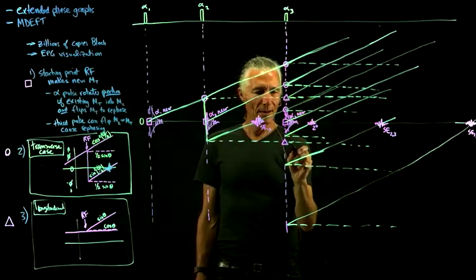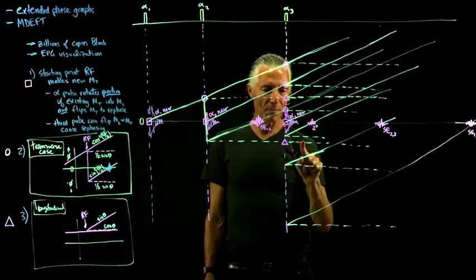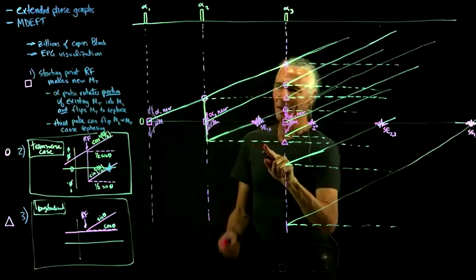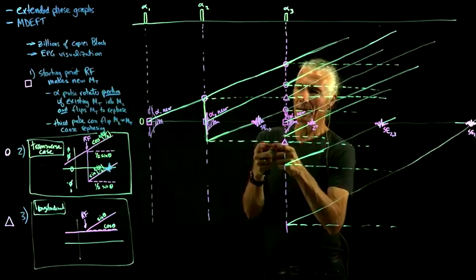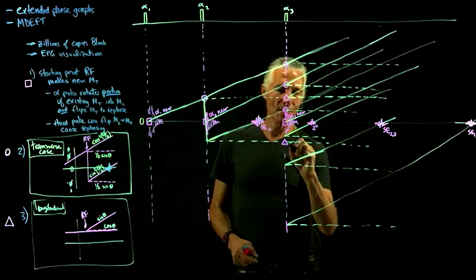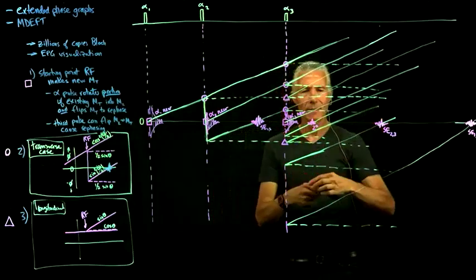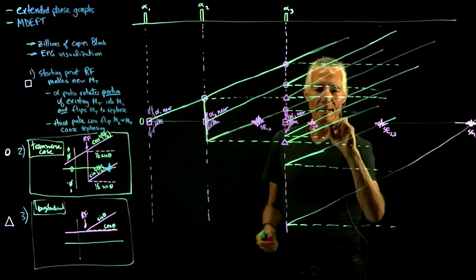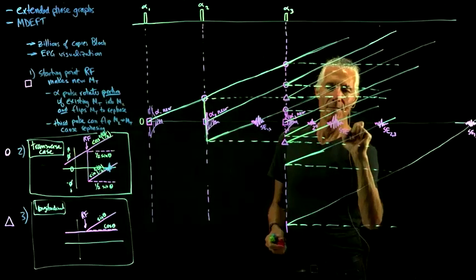But this one down here is the one that we're interested in, that makes the stimulated echo. And we're particularly interested in that because the decay of this signal is much slower because it's saved. It's still decaying, but it's decaying with a T1 constant instead of a T2 constant. And so that one is the one we're interested in, and that one comes out here like this. And that one crosses and makes this really big echo. So this echo is the stimulated echo, and that one's really big.